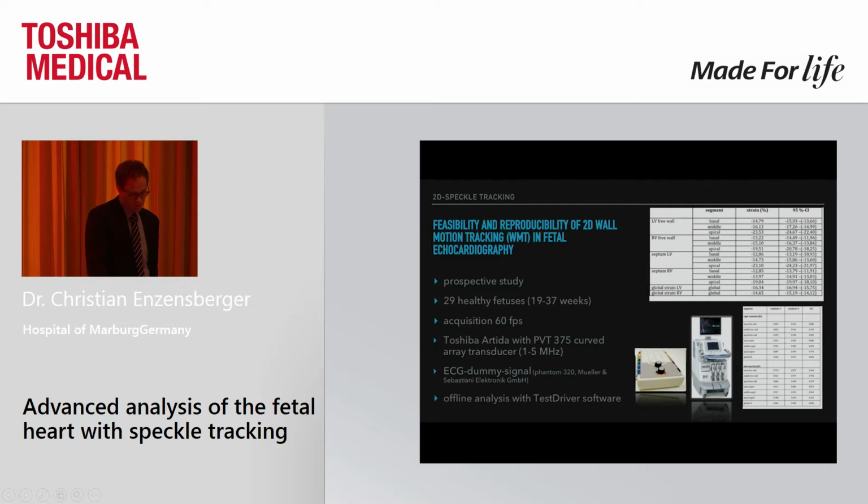The machine we used at the beginning was the Toshiba Artida, which you normally do not see in fetal echo, because it's more or less for adult echo. But we used this because of the possibility of changing to 3D, which I will speak about later on.